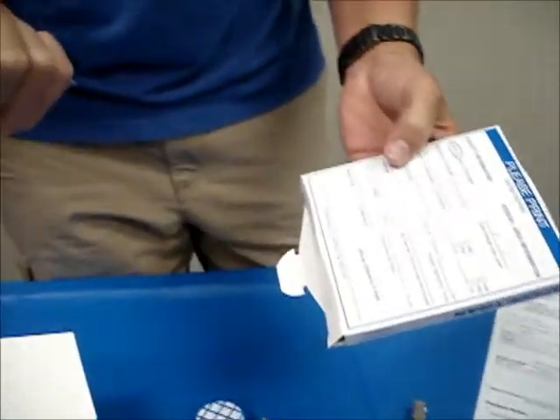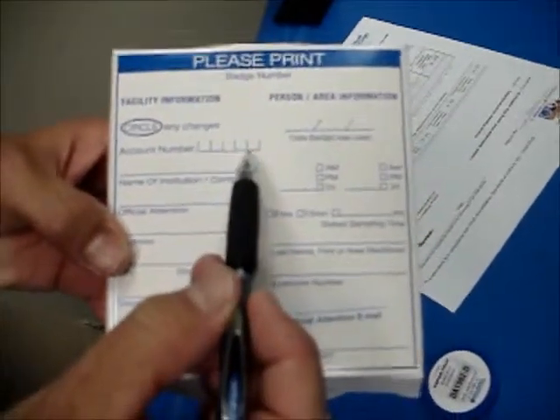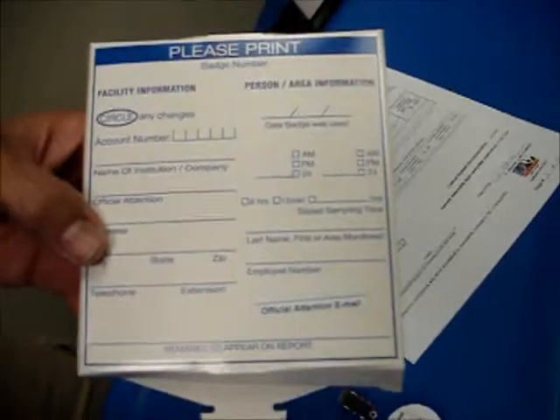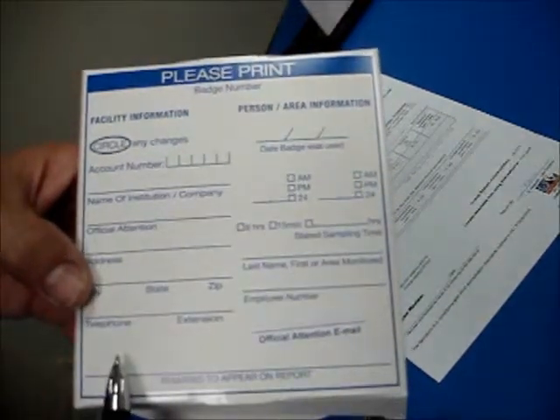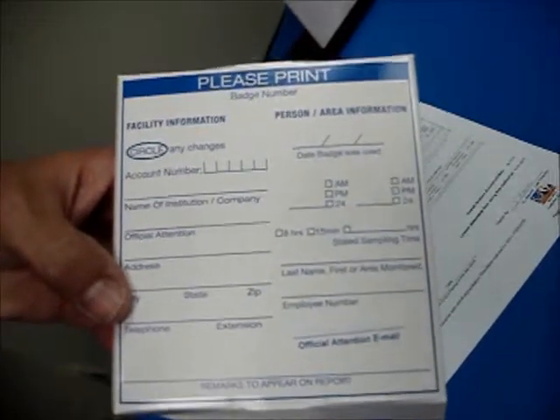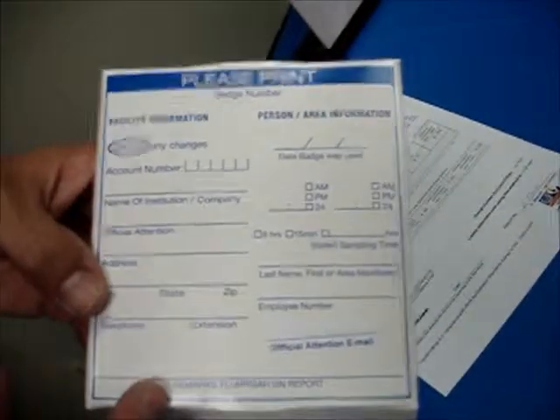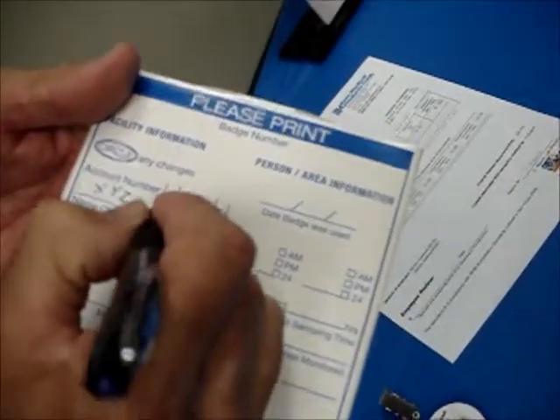On the outside of the mailer box, you're going to find an area where it says account number. If you've used the badges before, your facility was given an account number. You can just put that account number there and you don't have to fill out the name of the institution, address, city, state, etc. If you haven't used the badges before, then you will need to include that information. So let's call this XYZ Hospital.